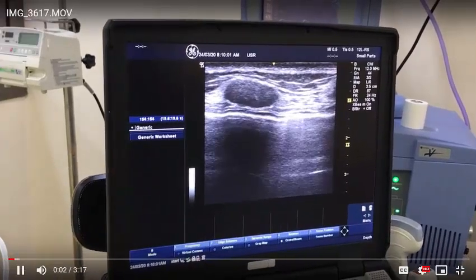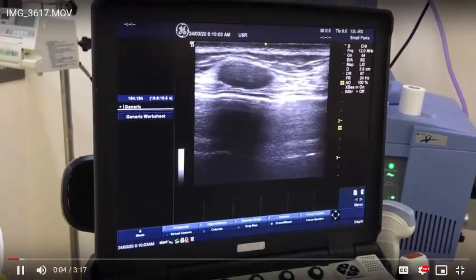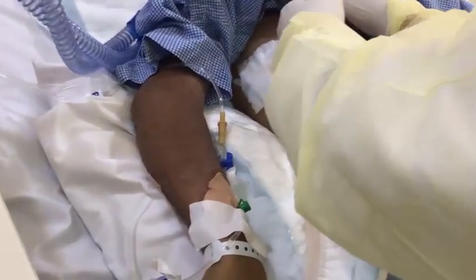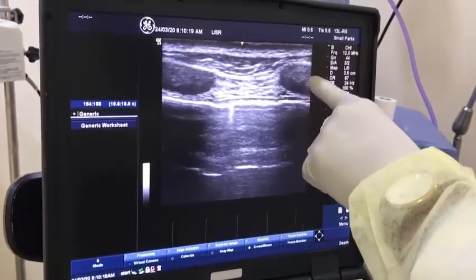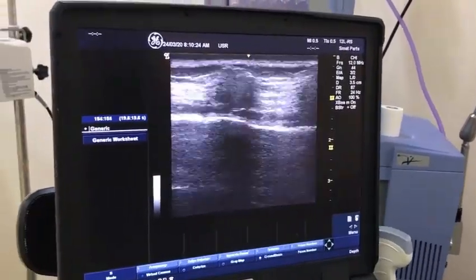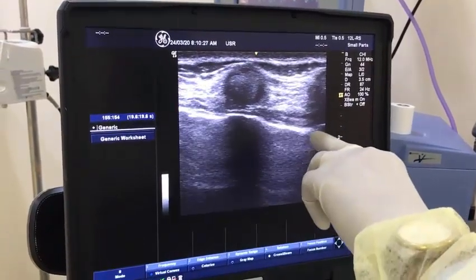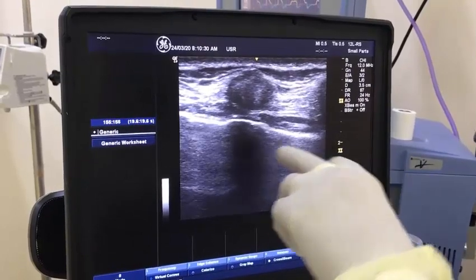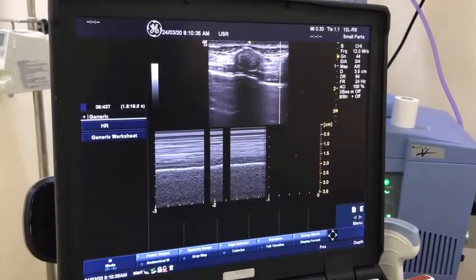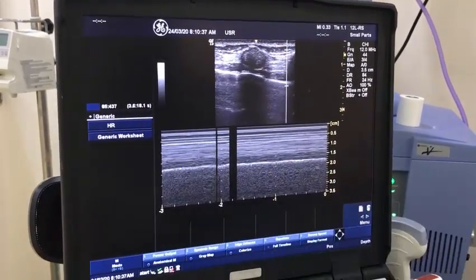This patient developed a pneumothorax; we inserted a chest tube and are now doing follow-up. Using a high-frequency probe in a sagittal view, you can see the upper rib and lower rib. In between, this is the sliding pleura — sliding pleura in between. There is mild sliding because of the chest tube, and in M-mode you will see the seashore appearance.